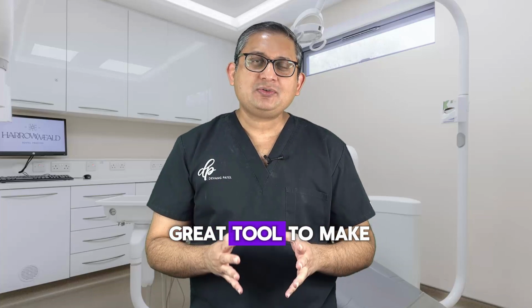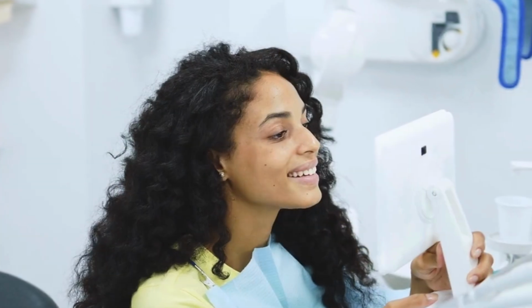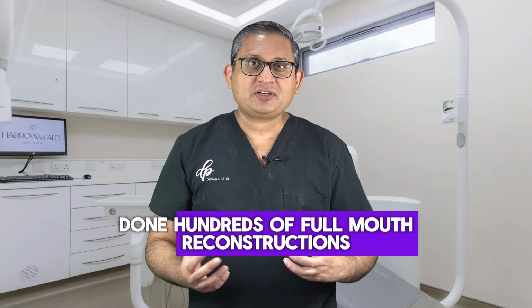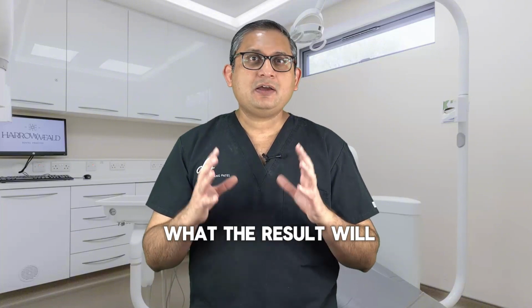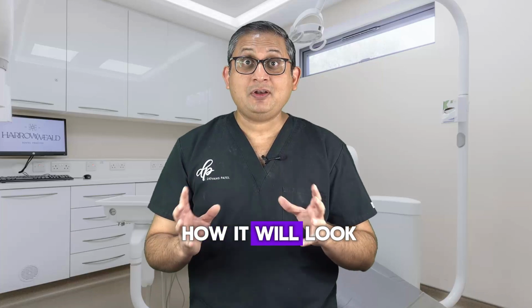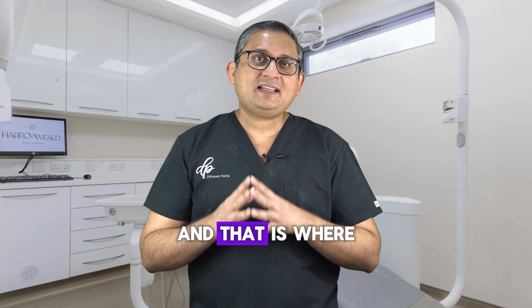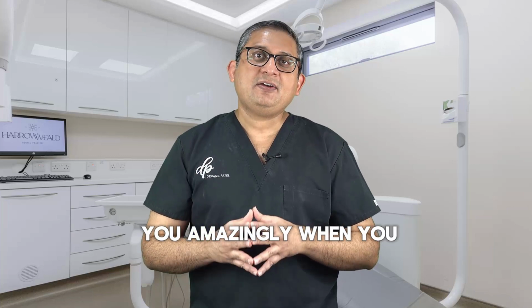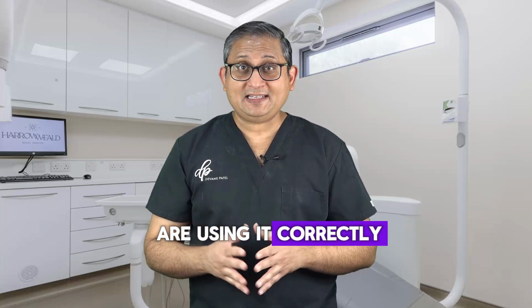You need to be able to visualize how the end result will look. And this is a great tool to make patients visualize how they will look, because maybe you have done hundreds of full mouth reconstructions and you know exactly what the result will look like, but the patient cannot imagine how it will look in their mouth. And that is where diagnostic waxes come in, and it will help you amazingly when you are using it correctly.